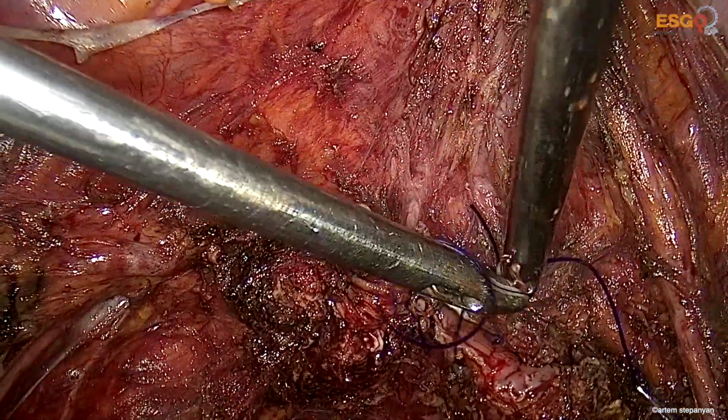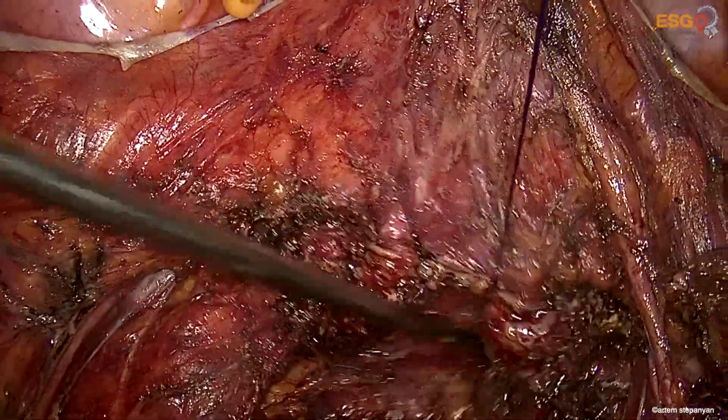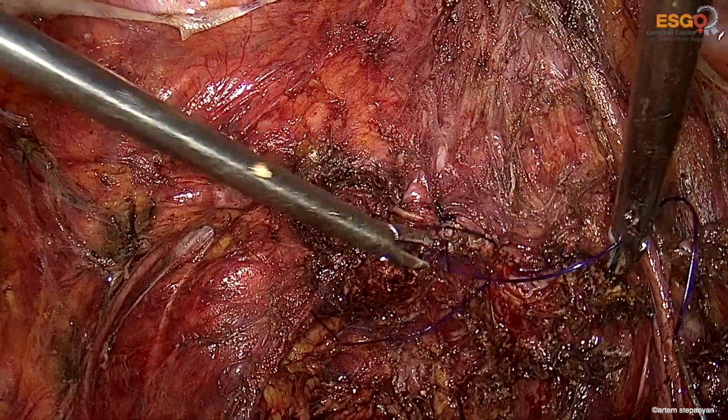And here we see the pelvis totally clean of the tumor, clean of the peritoneal implants of the borderline serous ovarian tumor.